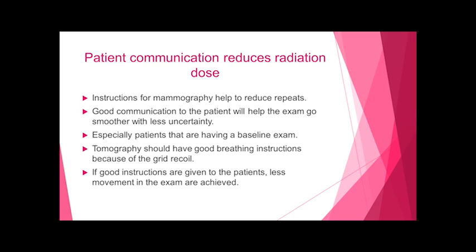So in tomography, make sure your technologists understand: are you going to have the patient hold their breath, or just hold it for part of the time? Then when the grid moves back in, are you going to tell them to hold their breath again? There needs to be some type of protocol for tomography for breathing techniques. If good instructions are given to the patients, less movement in the exam is achieved. So communication is very, very important.